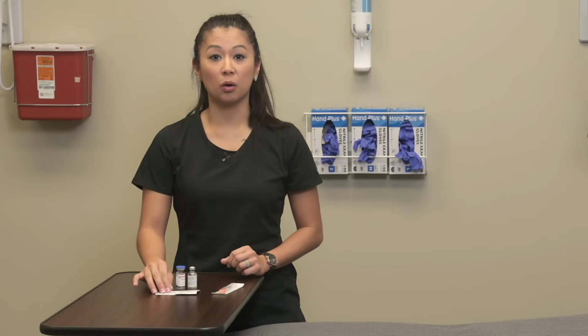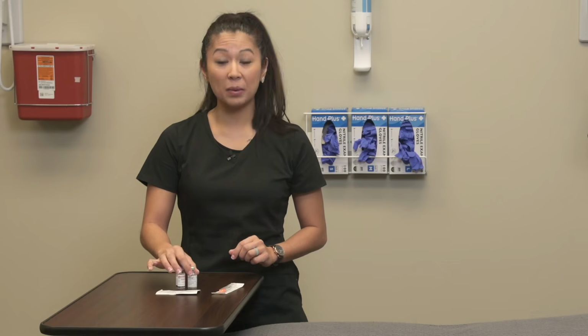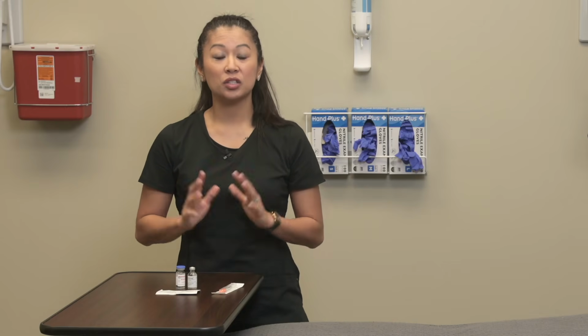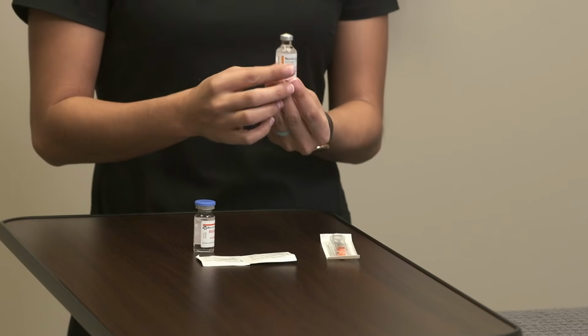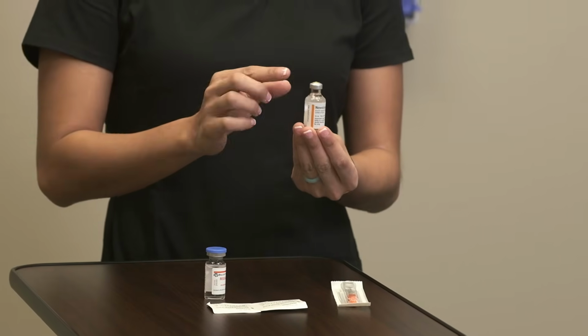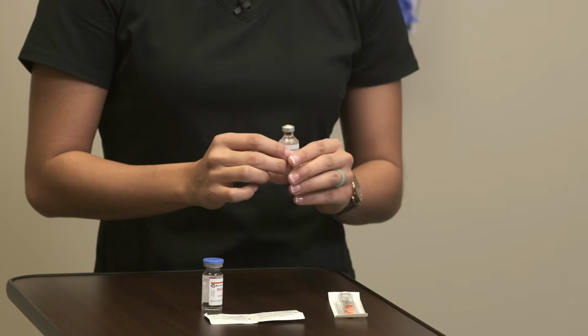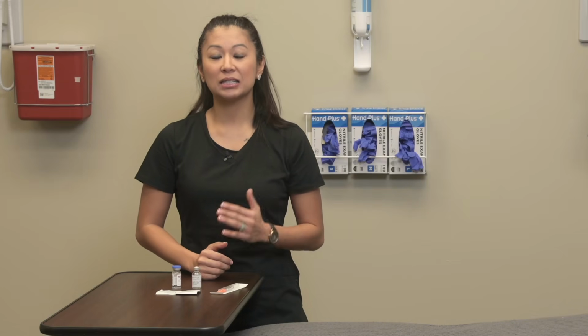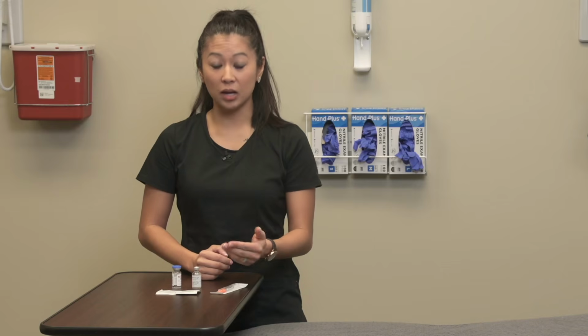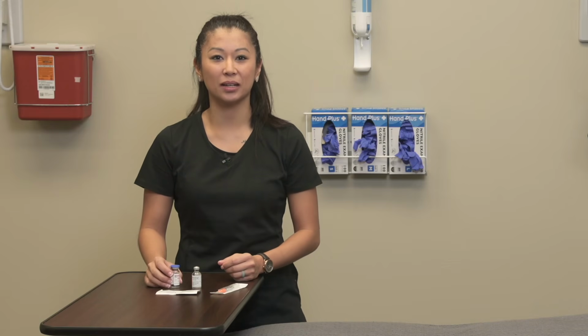All right, so we've got our needle. Also, we've got alcohol prep pads, and also I've got my vials of medication. One thing I want you to note before we draw up: we've got two vials here. One of these, as you can tell, is our insulin. However, this one does not have a top on it, like this one here with the blue. Anytime you go give insulin on your unit, it's very common that this is a multi-use vial. So just know that the cap may be missing when you go to get your insulin.